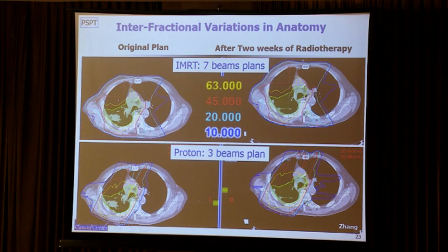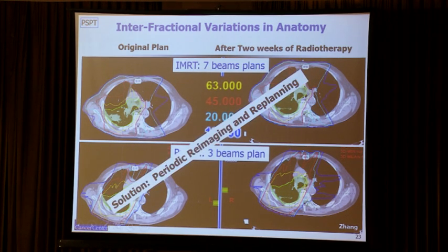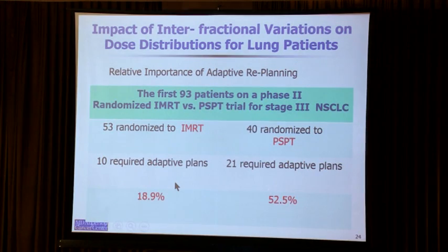This is just to illustrate that protons are affected to a greater degree by anatomic changes and motion, etc. And the solution obviously is periodic re-imaging and replanning.